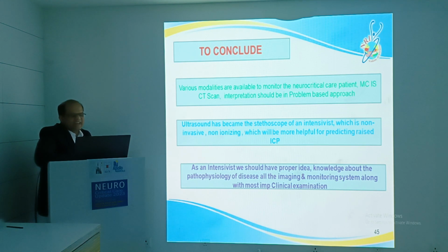So to conclude, various modalities are available to monitor the neurocritical care patient. Most common is CT scan. Interpretation should be in a problem-based approach. Ultrasound has become the stethoscope for intensivists, which is non-invasive, non-ionizing, and will be more helpful for predicting raised ICP. As an intensivist, we should have proper knowledge about the pathophysiology of the disease and all the imaging and monitoring systems, along with the most important, clinical examination.